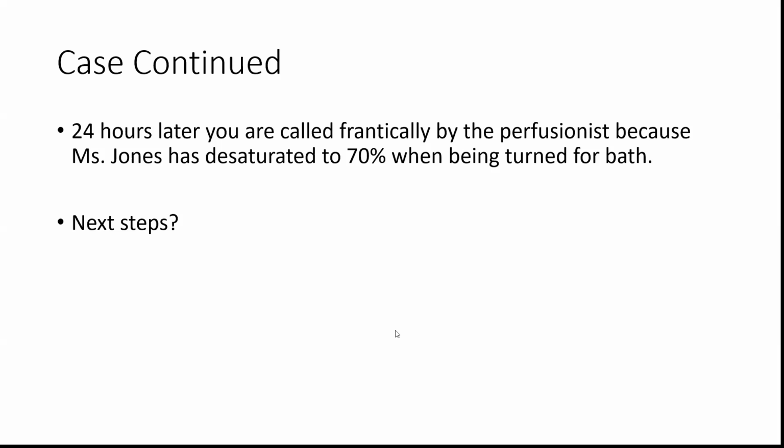Okay, good. The patient's sitting at 70%. So while you're doing the rest of this, you may, if you can, and sometimes you can't, it depends on how bad their pulmonary function is, but maybe you go up on the vent settings temporarily to help you.